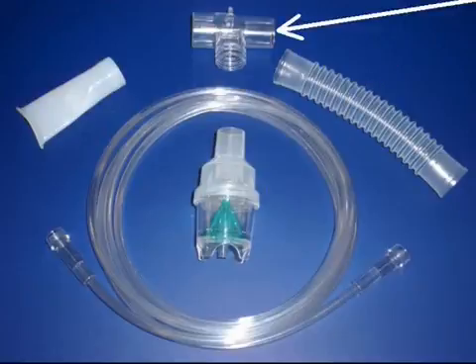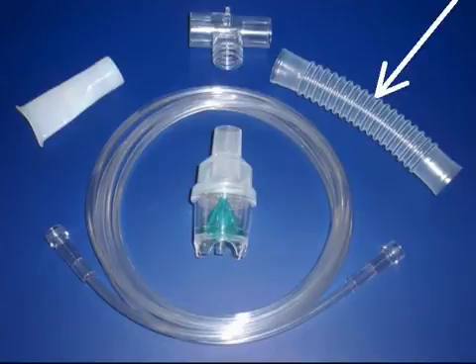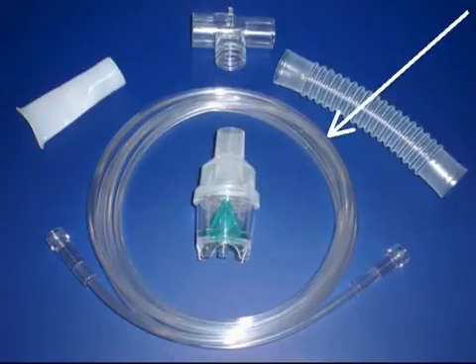A T adapter, a plastic mouthpiece through which the medication mist is delivered. A 6-inch corrugated tube, a 7-foot long air supply tube.